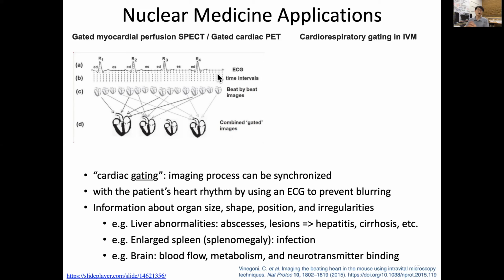So with this development, in fact, this technology or idea can also be used in another area. For example, optical imaging. Using optical endoscopy to image the heart is very challenging for the same reason. So we borrow the idea from here for endoscopy of the heart in an animal. It's a tiny, tiny heart, but it's a beating heart. Then the animal is also breathing as well. So for all this, we can use that idea in intravital microscopy.